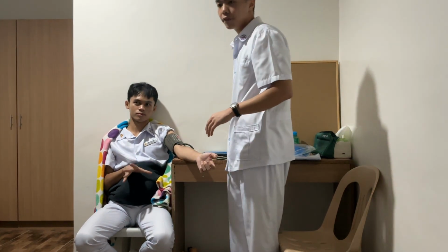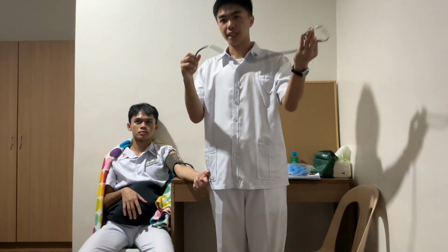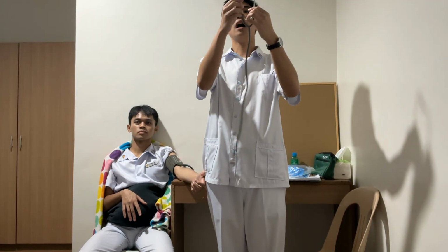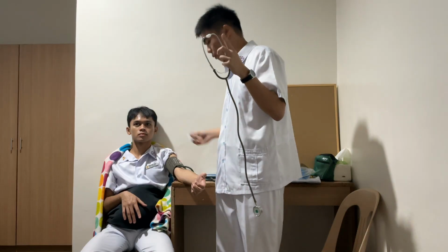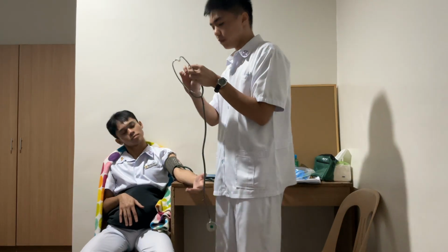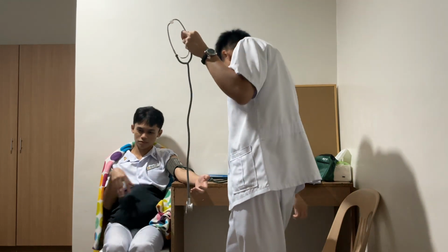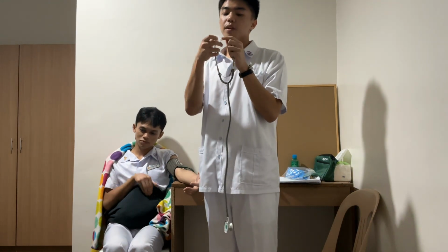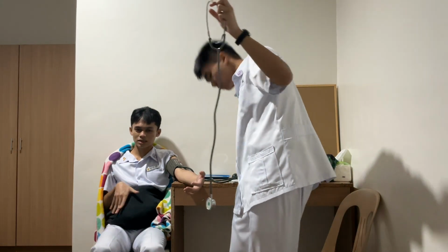So after that, I am then going to be using my stethoscope this time, checking the stethoscope. Then I am going to attach the ear. But before I attach it, I am going to ensure that it's clean. Why do we have to make it clean? Making it clean ensures that there is no dirt or debris that will hinder us from hearing the optimal sounds, because we want to hear it properly without any hindrance. Okay, so ear attachments are clean, discard.